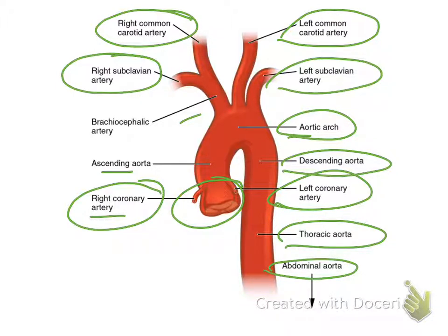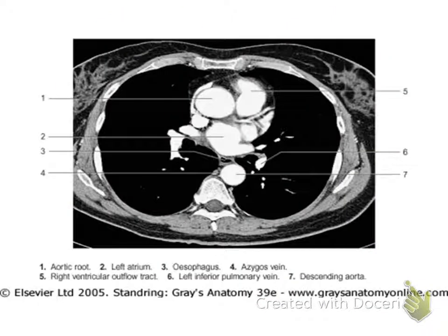I think we can move now to one more picture here. This picture, you may ask, what is this? Well, this is a cross-sectional cut of your chest. You remember we were mentioning the transesophageal view: anteriorly you can see your left atrium, your mitral valve and your interatrial septum.